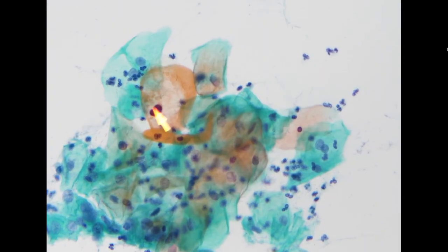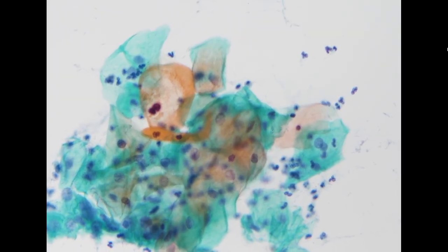Here we have binucleation, dark staining, sort of a koilocytic feature. And there are some areas with a more prominent koilocytic feature, such as this. And the amount of lesional cells is plenty. So for this case, we just call this LSIL. So this is our LSIL. We can directly call this LSIL.